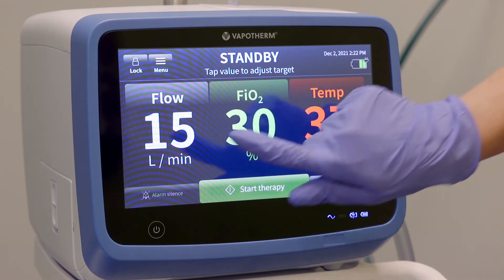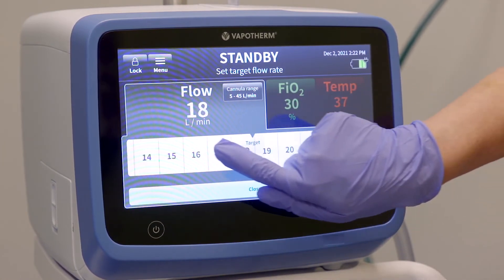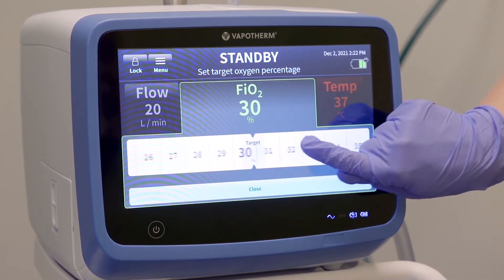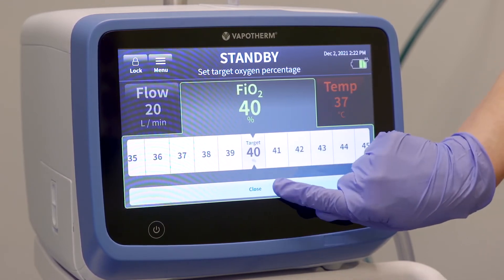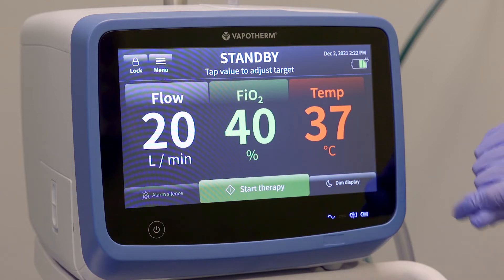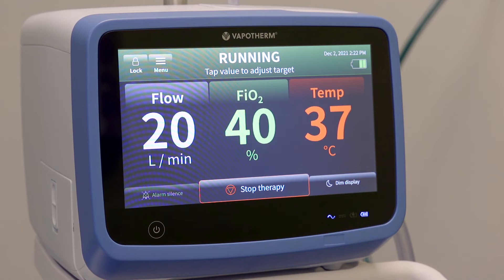To change the patient's settings, tap each parameter on the screen and scroll left or right to find the desired setting. Adjustments can be made among any or all of the three parameters before saving the changes. Tap the close button at the bottom of the screen to lock in your selections. The screen has an automatic lock after 15 seconds of inactivity to prevent accidental setting changes. When you are finished adjusting the parameters, hit the start therapy button. You will notice the top of the screen is now illuminated with a green bar and displays the word "Running."